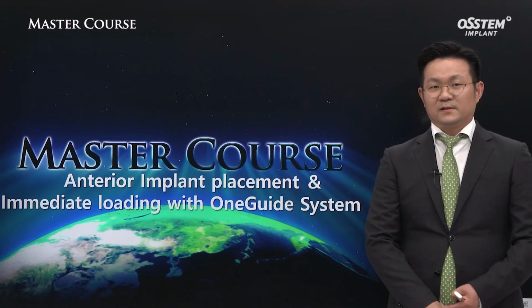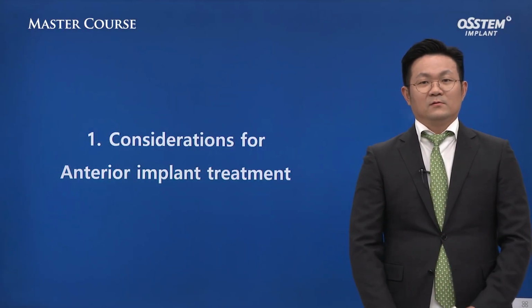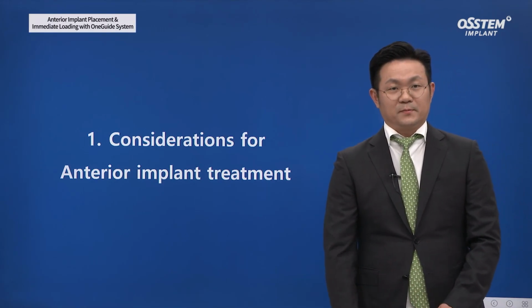I'm going to talk about anterior implant placement and immediate loading with the OneGuide system. So what are the considerations for anterior implant treatment?